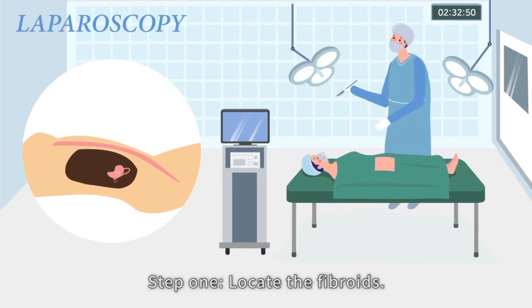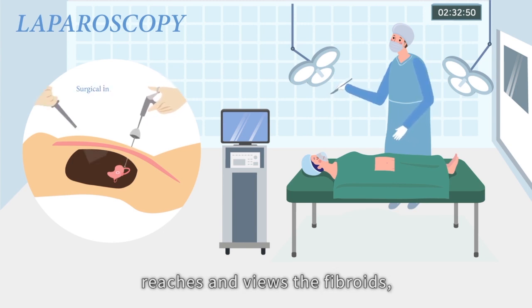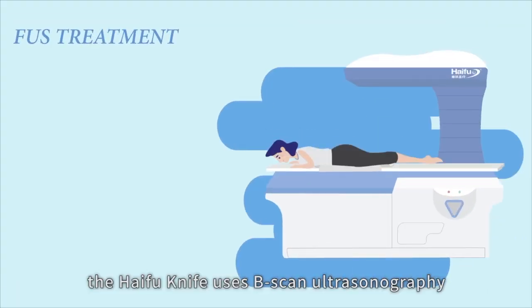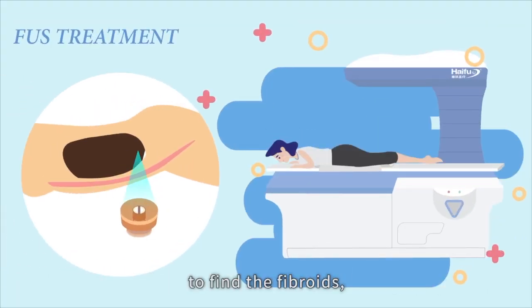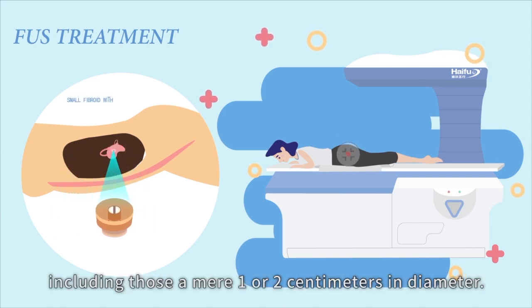Step one: locate the fibroids. Unlike a laparoscope, which via hands-on operation reaches and views the fibroids, the HIFU knife uses B-scan ultrasonography to find the fibroids, including those a mere one or two centimetres in diameter.